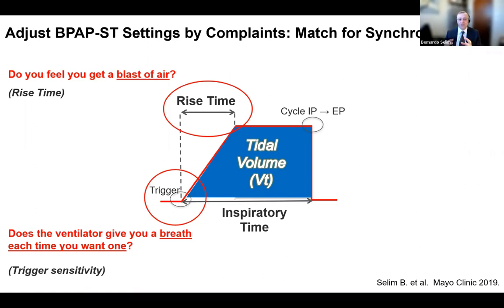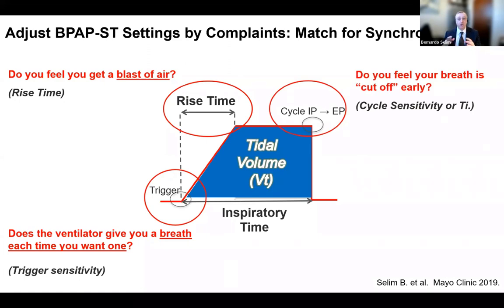If the answer is no, then you may need to play about this rise time. Do you feel that your breath is cut off early? That's another very important question. And if the answer is yes, then you have a problem with cycling, in which the machine may be cycling earlier than the patient wants, or the machine may be cycling later than what the patient wants.